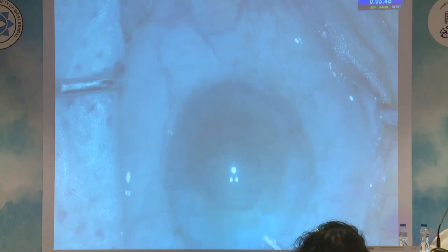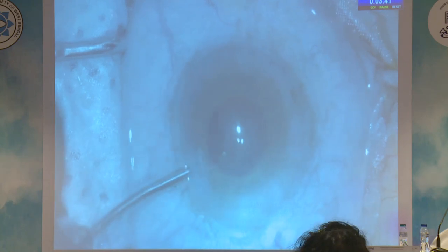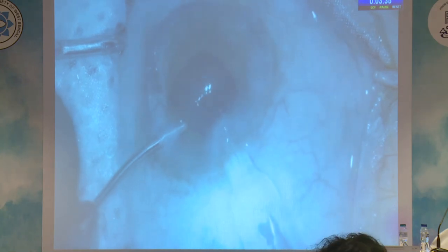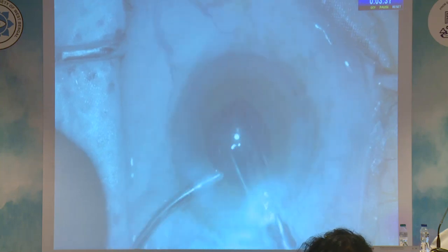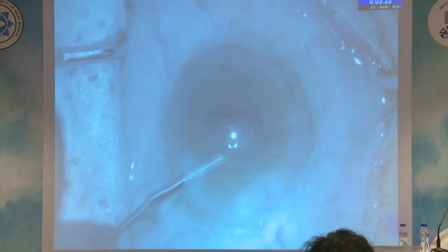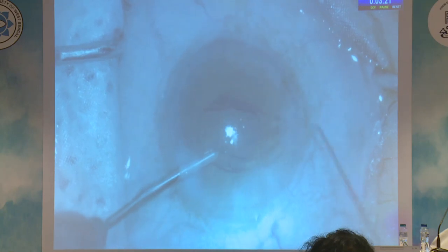In such cases what you do, just gently take your irrigation probe, get the iris free from all these ports, insert your irrigation cannula, stop the flow, start inserting your IOL, so the IOL is filling the port and no fluid is leaking out. In such a case the iris prolapse gets minimized, but as luck had it, in this case I had an IOL flip, but nothing to worry about.